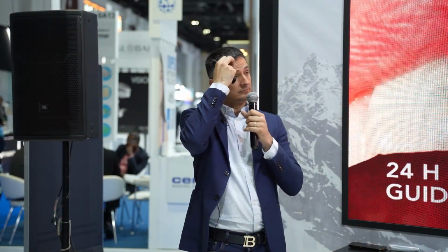Wide ridge, okay, not bad. If you have a wide ridge, let's say we will put a 4.5 implant. What I will do, the last drill will be 3.7, and I will continue only crestally till 4.5. So you will get the primary stability in the last 4 millimeters.